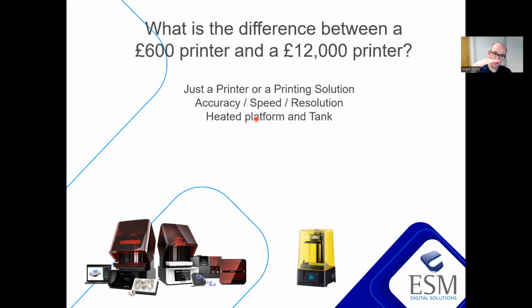So the build platform comes in, liquid flows, build platform moves out. The liquid's supposed to flow, but if it's too viscous, it won't flow as much as it should, and we may not get material flowing back in the way it should. SprintRay have a heated build platform and a heated tank, and that just ensures consistency.